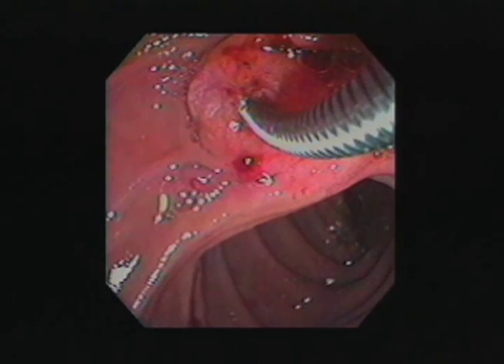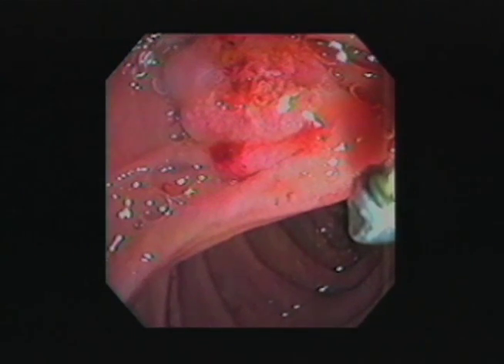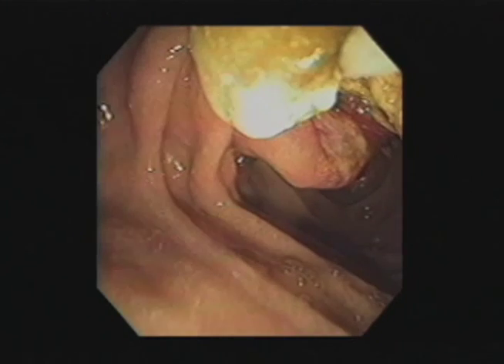Remove the lithotriptor from the endoscope with the basket in a closed position. To retrieve the crushed calculus, an assortment of retrieval devices or balloons may be used.